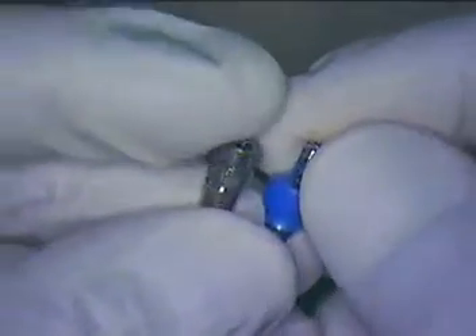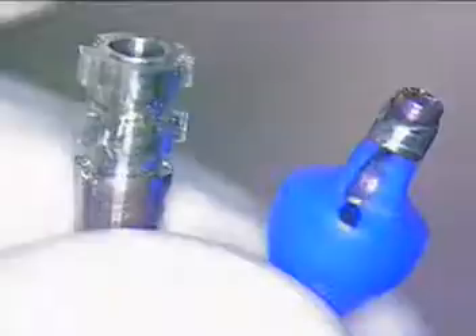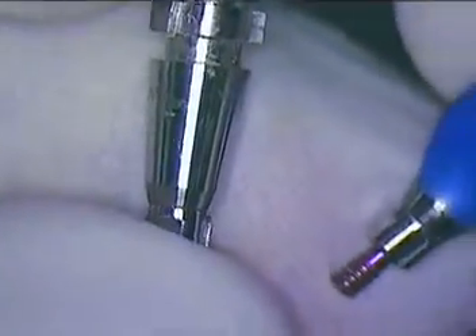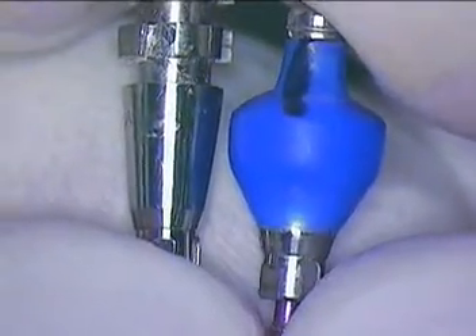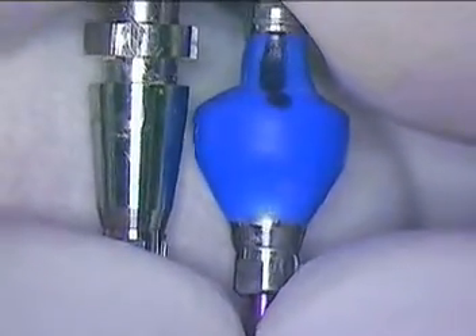We're back live. This is the second segment of possibly three. This is Dr. Jerry Cuomo. What we're doing right now is comparing the bone level impression copings. This happens to be an open tray coping that could easily be modified. This is actually a closed tray, already modified, to give us an emergence profile that would be quite acceptable for this bicuspid region.